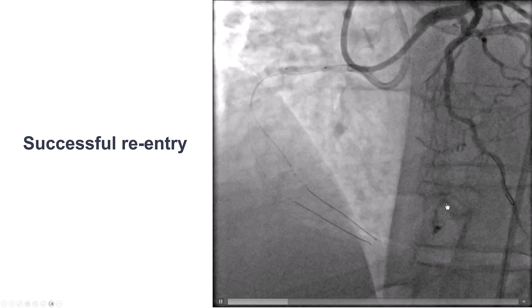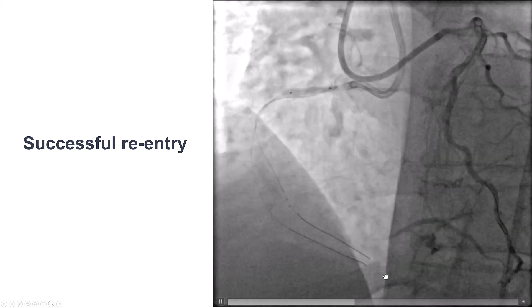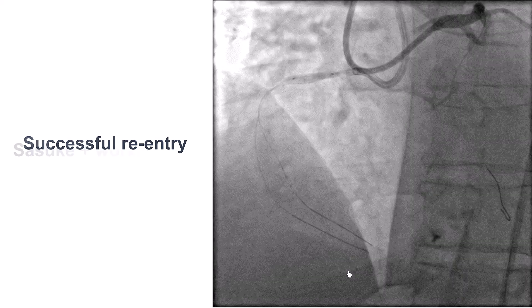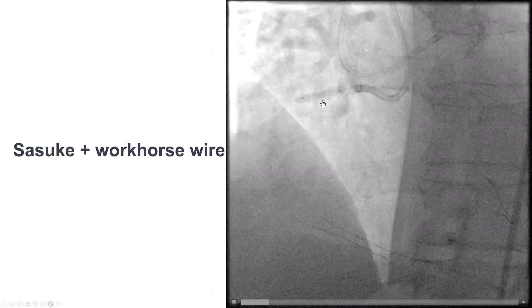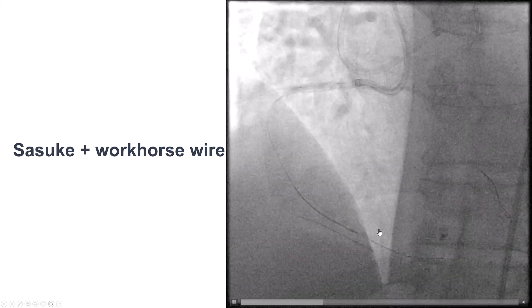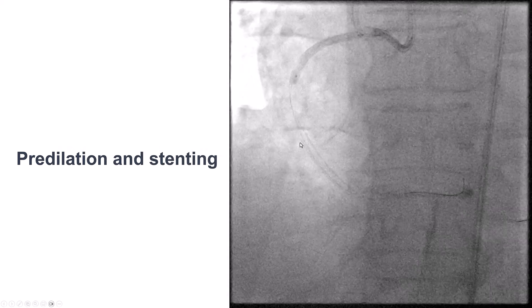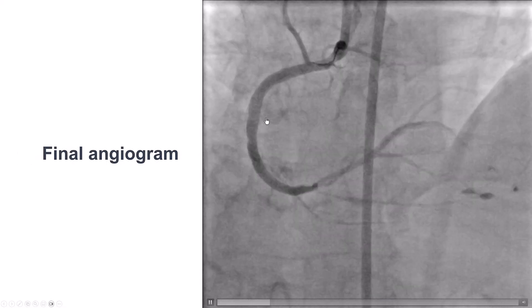We had some staining of the septals from previous crossing attempts. We then performed stingray reentry, which this time was successful. We used a Sasuke to advance a workhorse guide wire into the right coronary artery, PDA and PLV, then pre-dilated and stented.